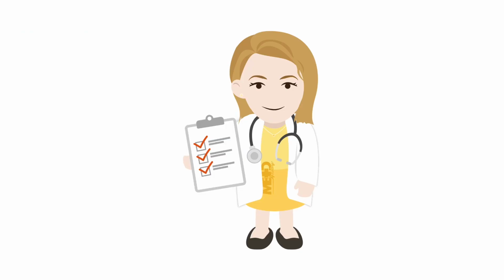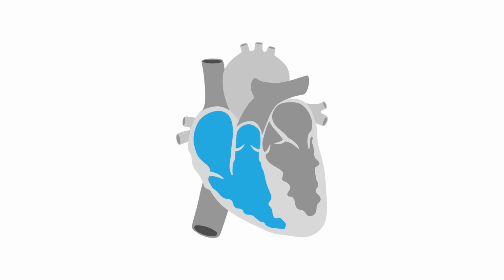At the end of this med mastery lesson, you will be able to make use of tricuspid regurgitation to estimate the systolic pressures in the right heart and pulmonary artery. The pressures in the right heart are lower than in the left heart because blood leaving the right ventricle only has to travel as far as the lungs.